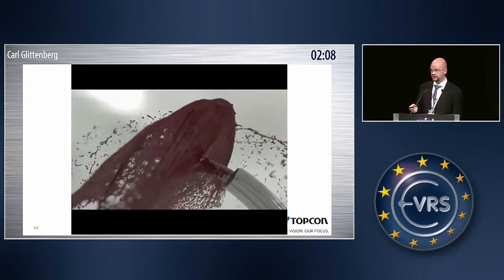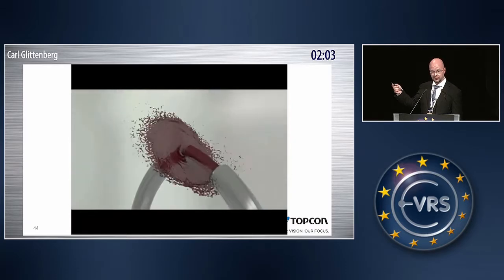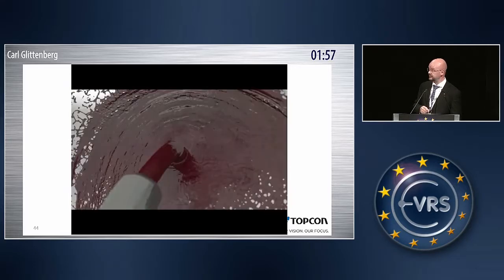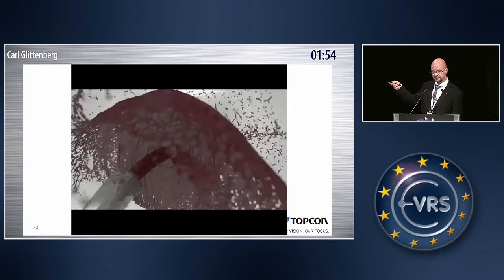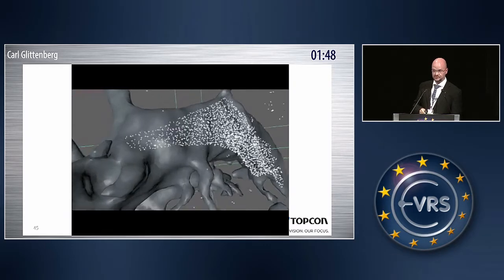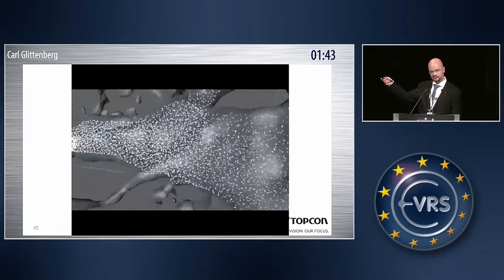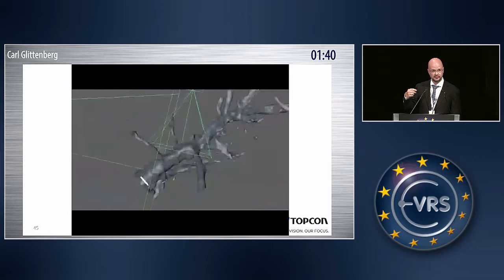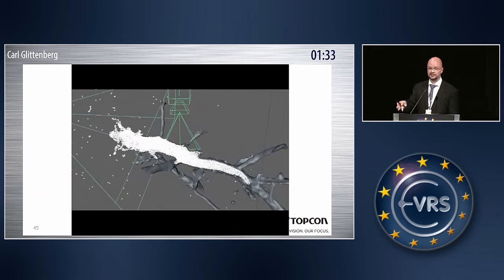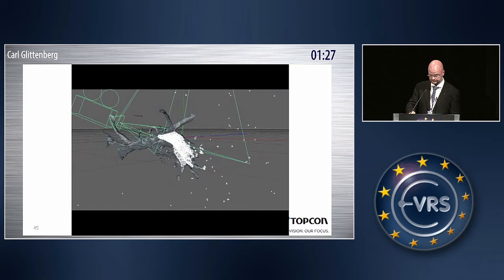So this is a simulation I created of blood flow, just to see, as a proof of principle, if I could correctly simulate blood flow. And I wanted to see if I could take this information, with the viscosity and all of these formulas, and see if I could plug this directly into the vessels I'd segmented before. And it's possible. So you can do a fluid dynamic simulation of the actual vasculature directly of the patient that you're seeing. Now this is of course not possible on the machine, but it shows you what's possible to do with the actual data that's coming out of the machine. So this is some of the work that I'm working on in the future.